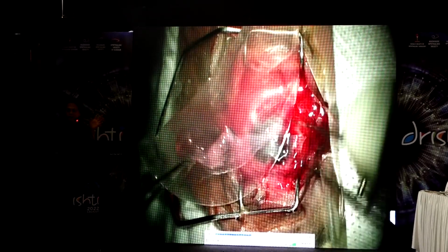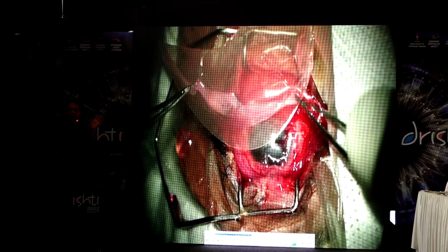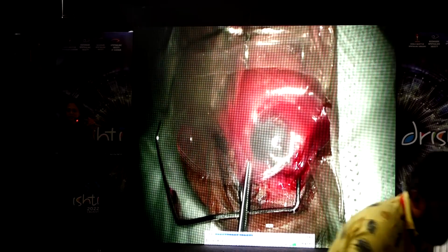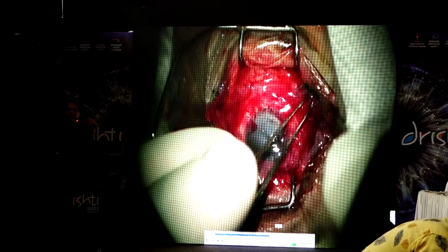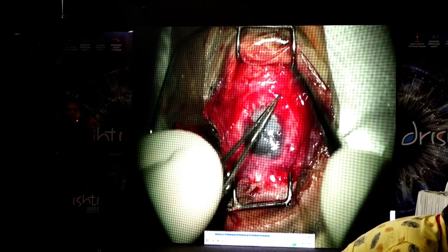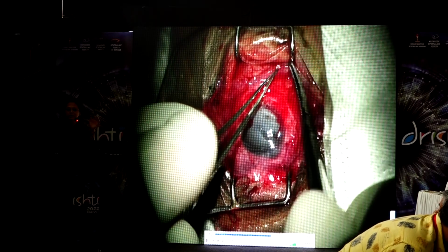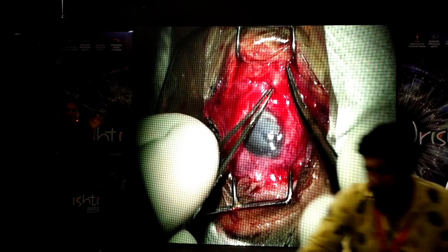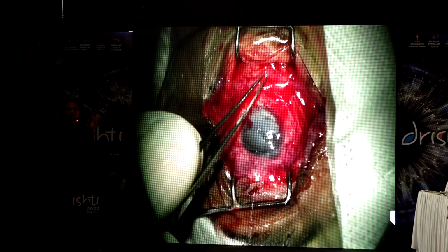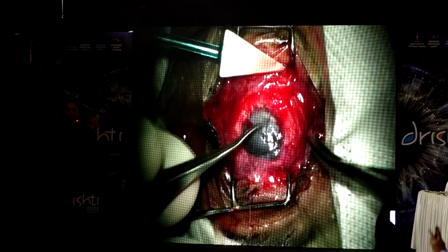And what you probably did not see here is there is a lot of symblepharon here in the superior part, which is all attached to the lid. It had to be separated before the speculum was inserted. So the membrane is now taken out, fashioned onto the ocular surface and sutured onto the edges. All necrotic material has also been debrided here, and it's being sutured onto the edge of the conjunctiva, which is near normal here.